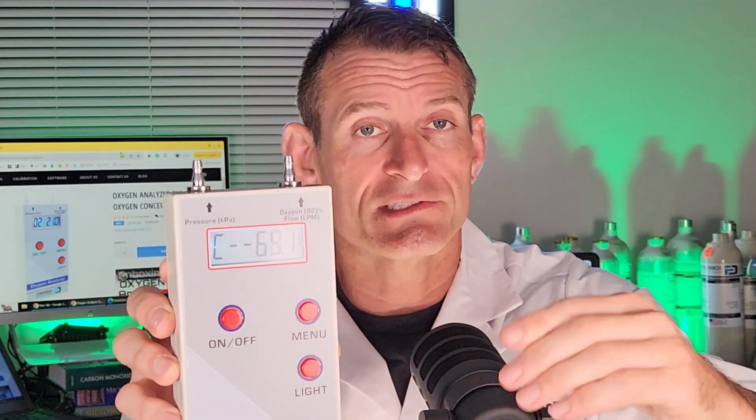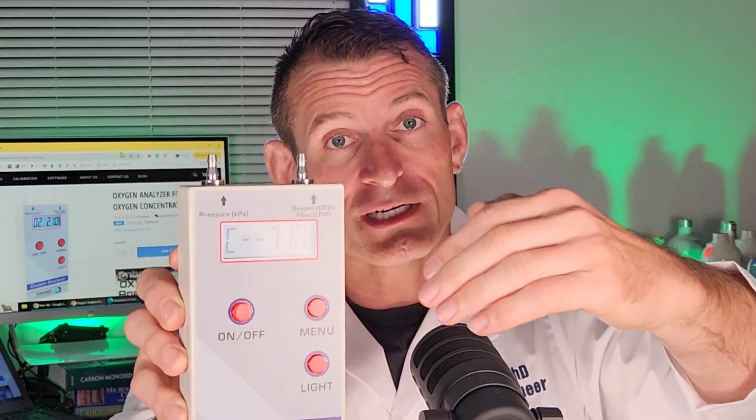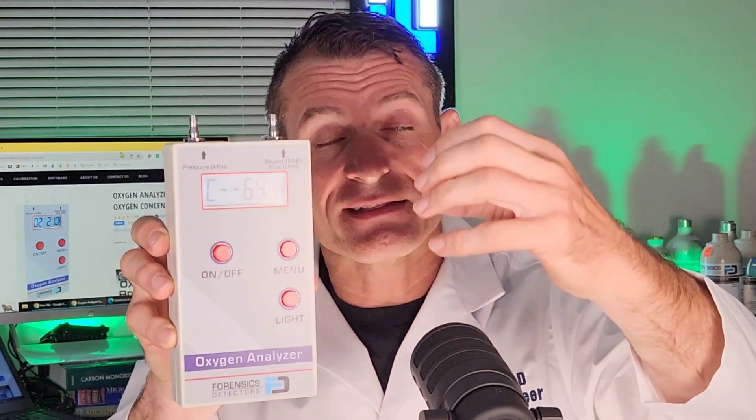When we take the tubing off, the numbers will not go down. This analyzer is a little different — it's not a flow-through analyzer. Whatever air or oxygen you put in, it's going to stay there until you refresh it with a new test sample or pressurized air. It's analyzing what's in the ultrasonic cavity that detects the oxygen.